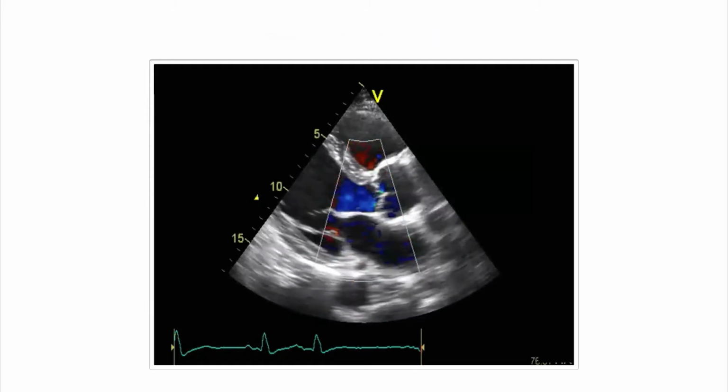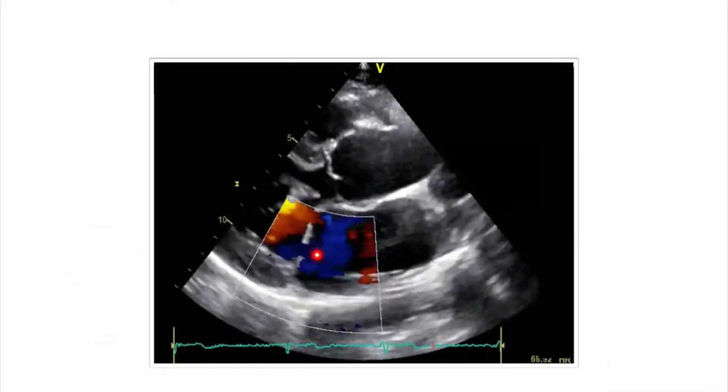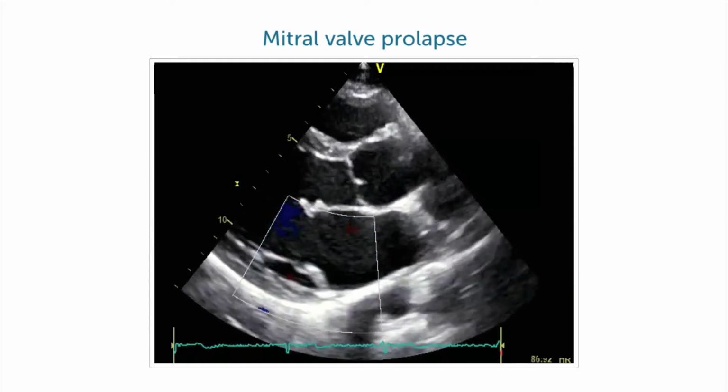And I guess you will agree, Anna, there's also some degree of mitral regurgitation. The same jet, smaller maybe, representing mitral regurgitation. Yeah. And an example of a true mitral valve pathology, the mitral valve again looks awkward, it's very thickened, and it prolapses. This is your very first mitral valve prolapse you've seen. You're going to see a lot of them in the chapter on mitral regurgitation.